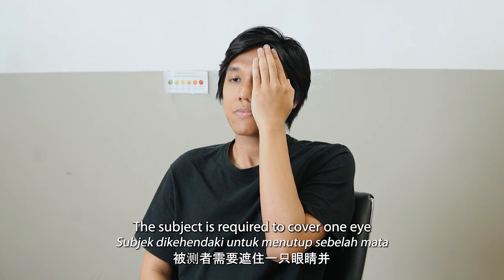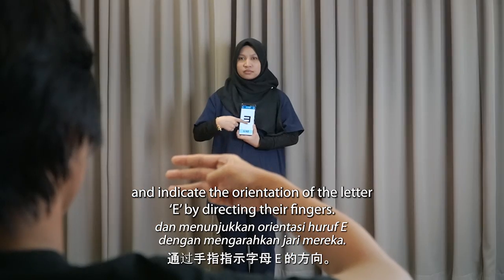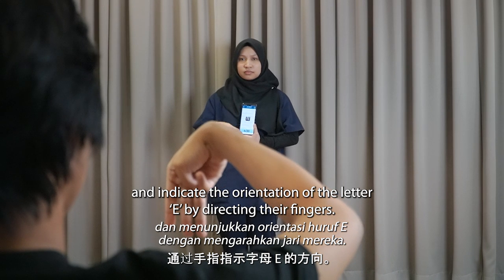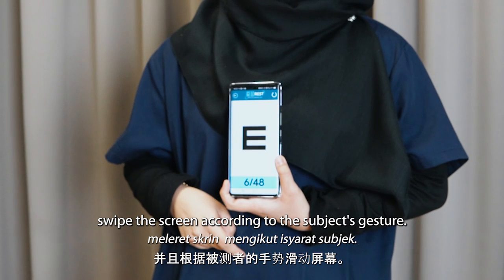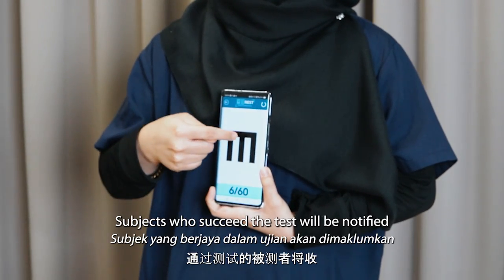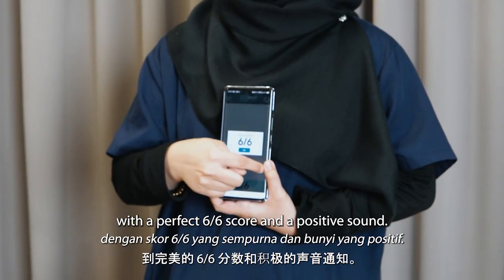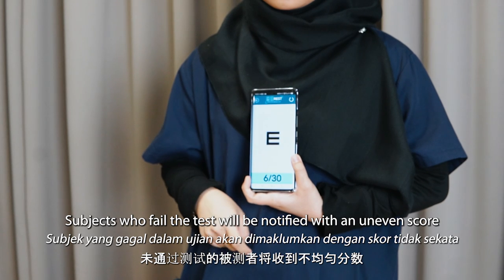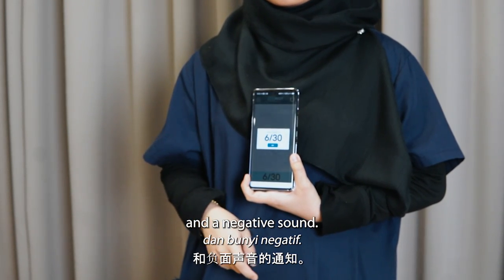The subject is required to cover one eye and indicate the orientation of the letter E by directing their fingers. Another individual will be responsible to hold the phone and swipe the screen according to the subject's gesture. Subjects who succeed the test will be notified with a perfect 6/6 score and a positive sound, while subjects who fail will be notified with an uneven score and a negative sound.